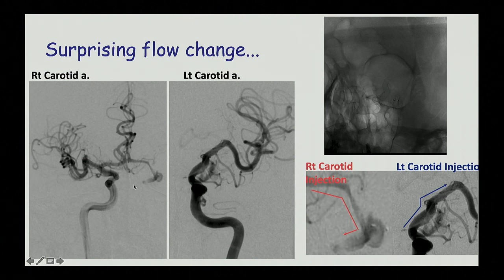So at this time, I decided to do nothing, because I may go inside the flow diverter and use a balloon and change the flow and probably stop the flow coming from the right, but then maybe I will close the posterior cerebral artery. So we need DSA, and we have sometimes very strange vascular remodeling due to the flow diversion.